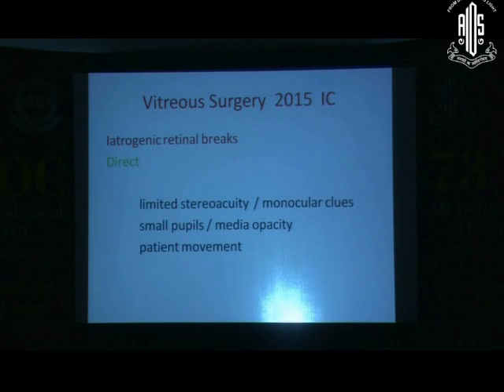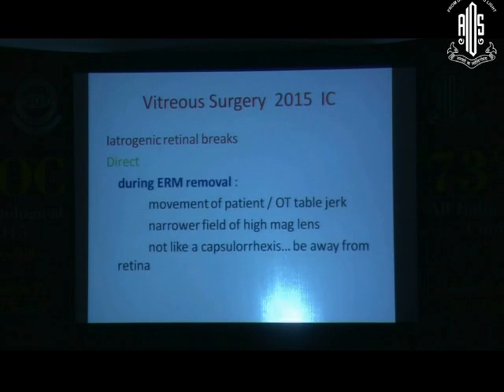Direct retinal breaks may be induced in a new vitreoretinal surgeon or a young surgeon when he is not used to different visualization systems. We have to use a high magnifying lens when we deal with the macula, and limited stereo acuity and monocular clues have to be used in some cases when the pupil is not dilating. Patient movement also has to be looked into, and we have to do good teamwork so that nobody pushes on the operation table or your chair during fine movements over the macula.